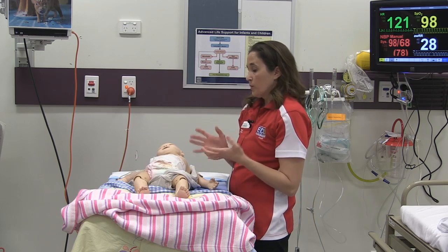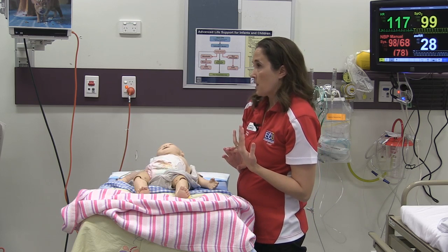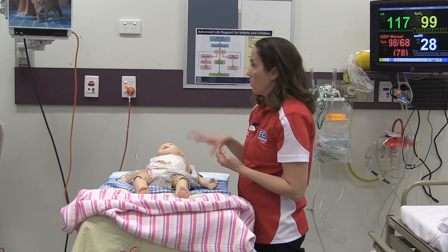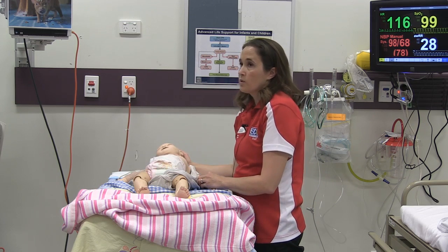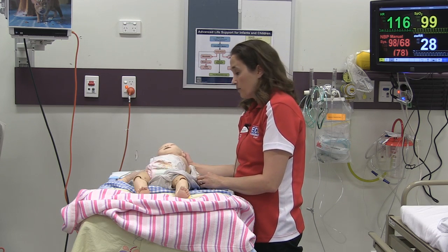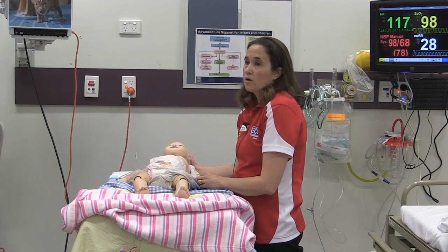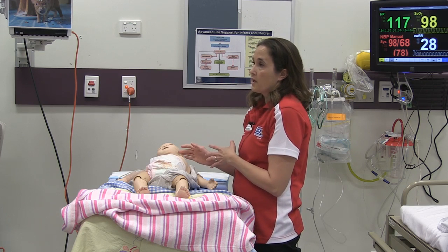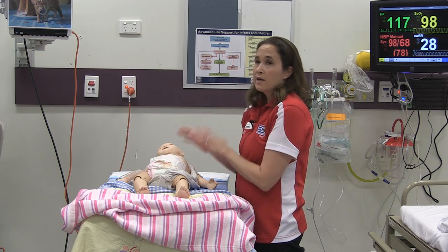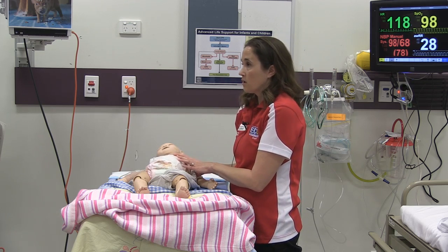The purpose of the room orientation or room familiarization is really, again, to show them how to call for help in the setting, show them where the supplies are and what the equipment they're using, let them have some hands-on time and understand what the limitations of the Manikin are. And it's really based on the level of learners. So there may be a skill that you've written into one of your scenarios that you want them to practice ahead of time, or a number of skills. Give them some time or chance to actually do those skills here.